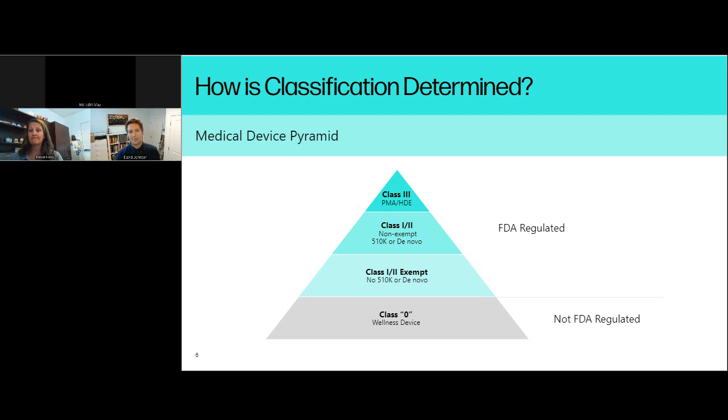That's it. So when it comes to patient-specific, and this is where I think additive is going to play a key role just because it can be adaptive. Yep. As far as the duration and maybe monetary value of testing, what are you typically seeing for a standard mass-produced medical device versus something that is more patient-specific?